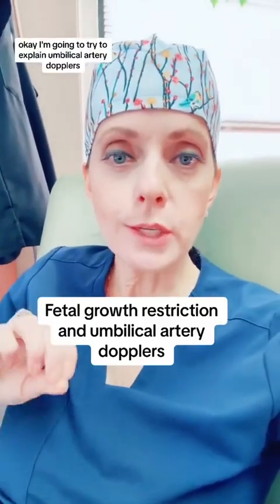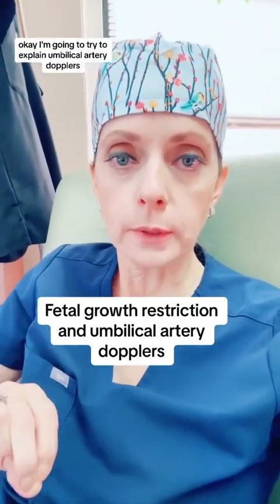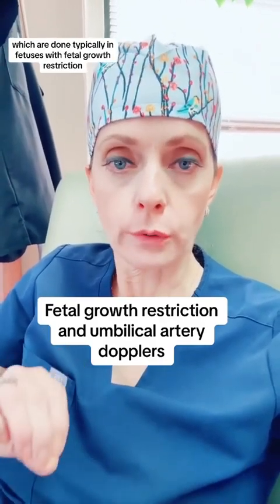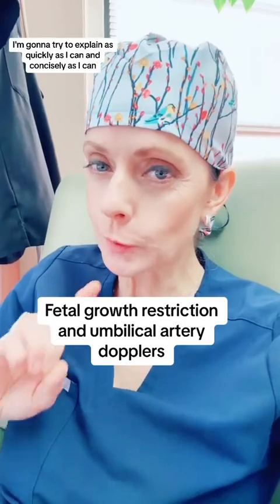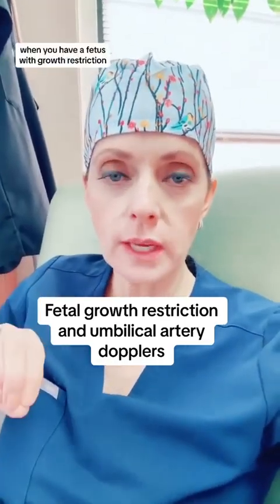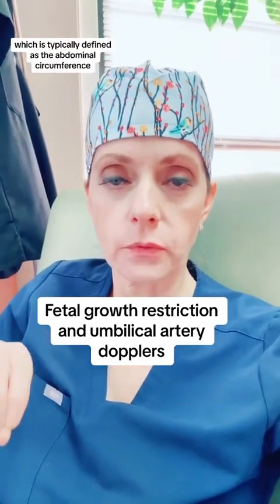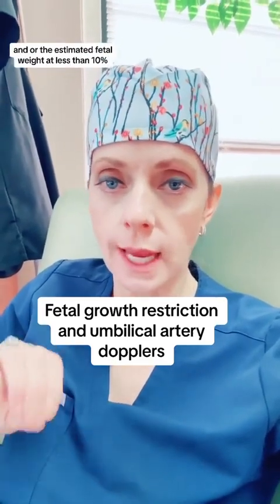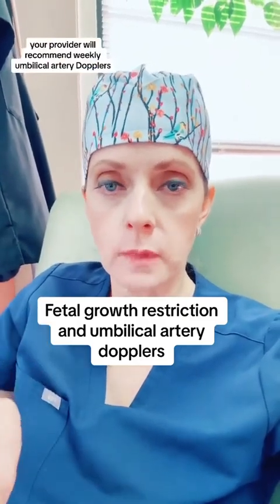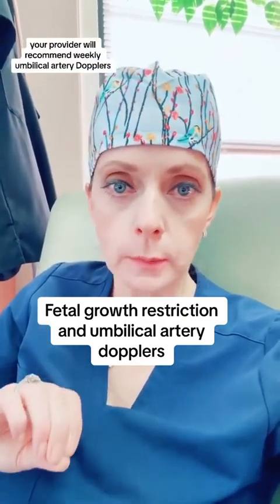Okay, I'm going to try to explain umbilical artery Dopplers, which are done typically in fetuses with fetal growth restriction. I'm going to try to explain as quickly and concisely as I can what that means. When you have a fetus with growth restriction, which is typically defined as the abdominal circumference and/or the estimated fetal weight at less than 10th percentile, your provider will recommend weekly umbilical artery Dopplers.